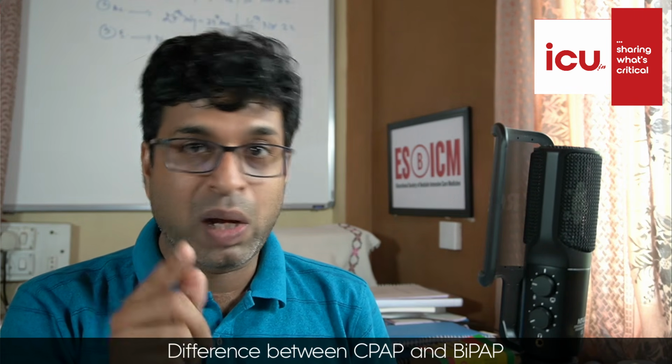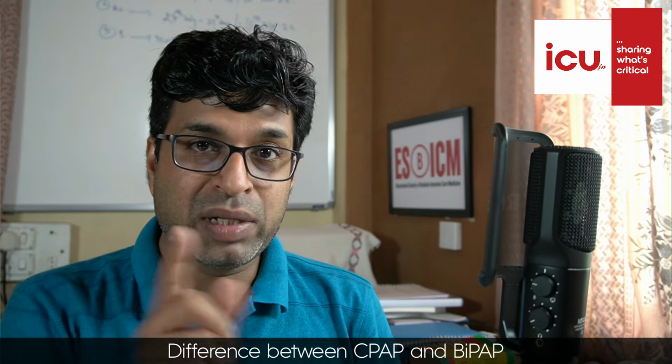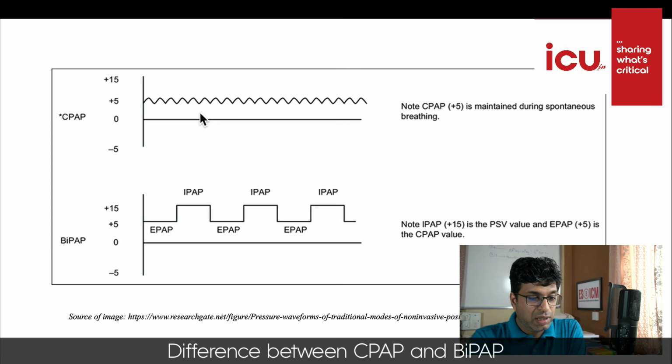So we'll now see the graph, and you will pick up this concept. Now you see here, this is your pressure and this is your time. You are seeing in CPAP there is a continuous positive pressure. This is a respiratory cycle, with a little bit of variation, but usually it remains straight. So a +5 is maintained during spontaneous breathing, whether it's inspiration or expiration.